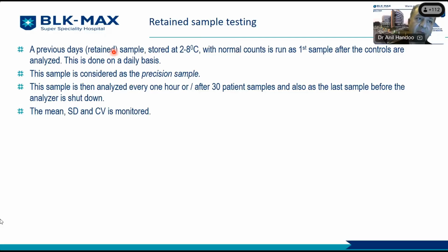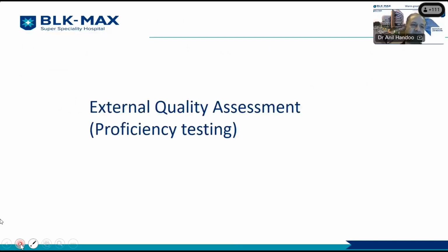But at the same time, you're also generating data. So when you generate the data, you're also able to do what is called a precision study, which is nothing but an IQC study or internal control study. Here again, you are able to use the data from the previous day, and this can also help you monitor your analyzer performance. You must remember that as time advances, a lot of the parameters do get altered over 24 hours, and you have to determine your acceptability limits for retained sample testing when you're doing it on a hematology analyzer or any other analyzer for that matter.